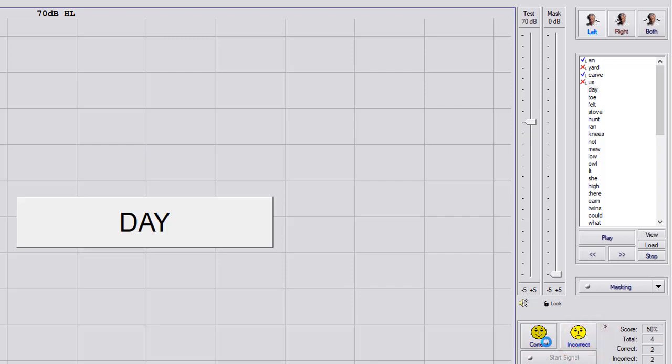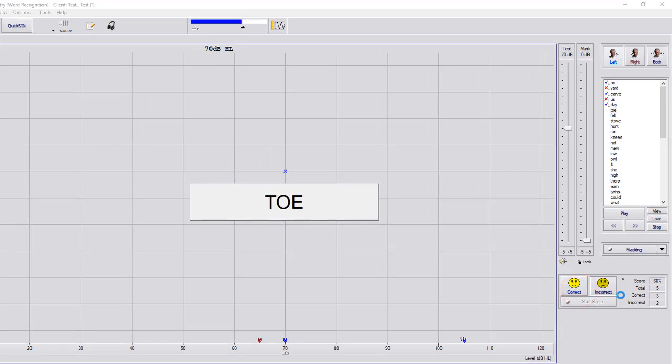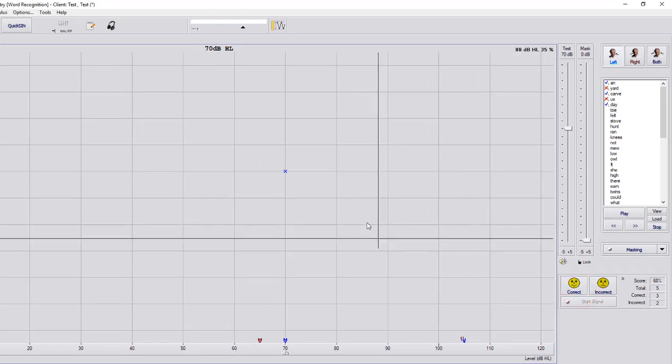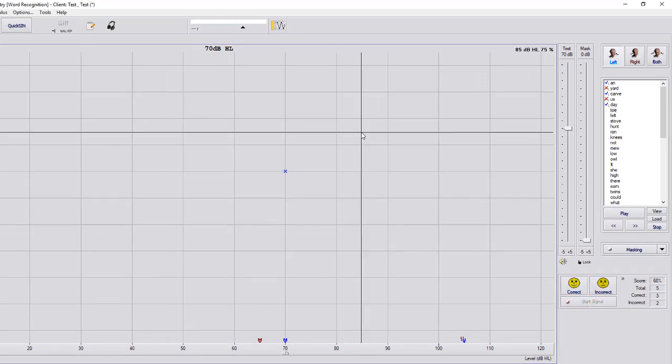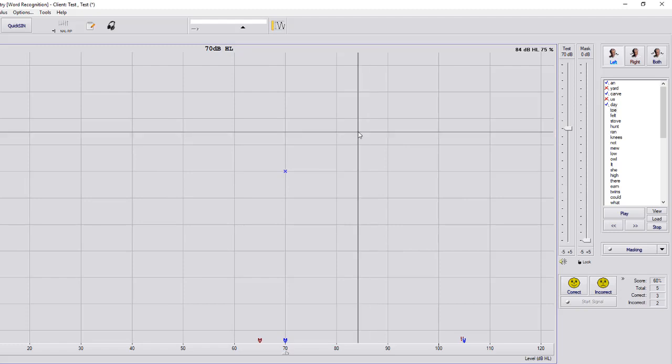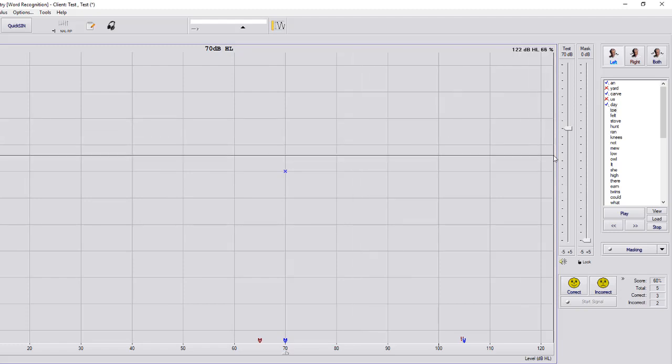And back in the options, we have it set for 25 words. So once we get to the 25th word, a prompt is going to come up in the center of the screen, and it's going to say auto limit reached. It's just basically letting you know that you're at your 25th word to switch yours.